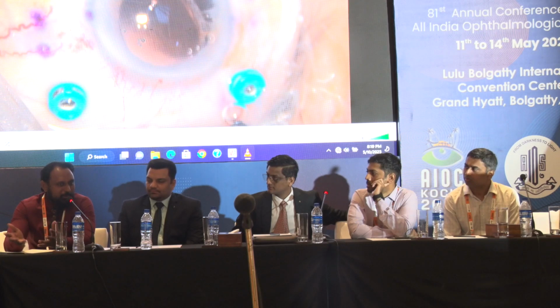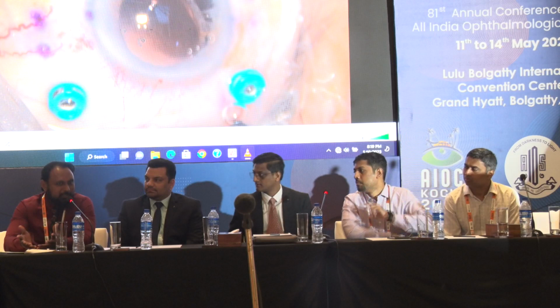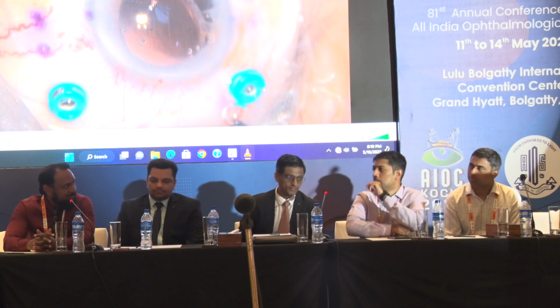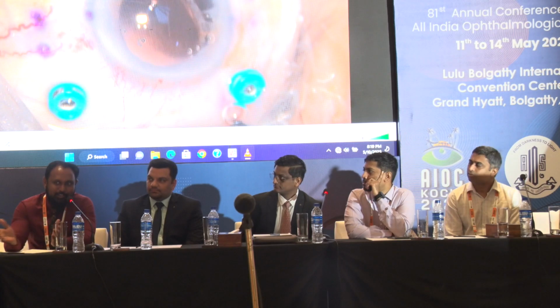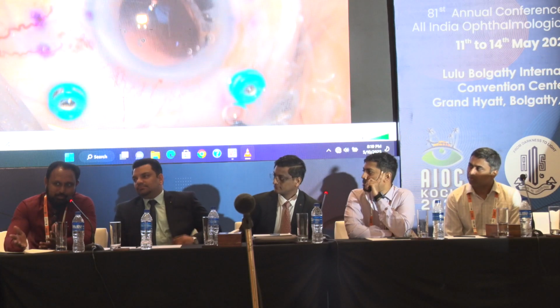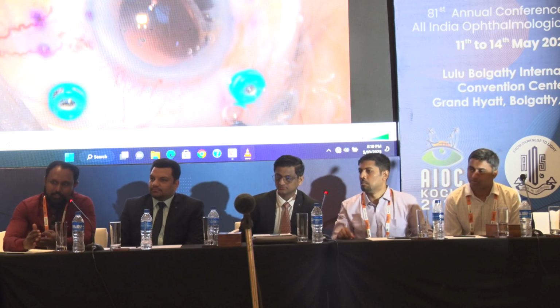Sometimes when you have high volume cases also, I think claw lenses have given very good results as far as secondary IOLs are concerned. So it should also be one of the options. As Vaibhav said, you should know all the techniques and apply what is suitable for that particular patient, at what point of time you are having the complications, and what you are comfortable with. I think these 3 things are the key take home from this session after knowing all the techniques.